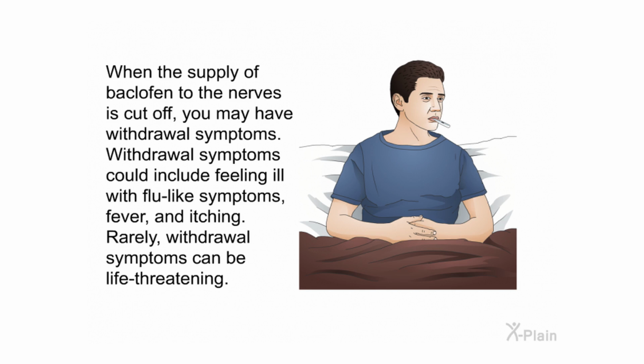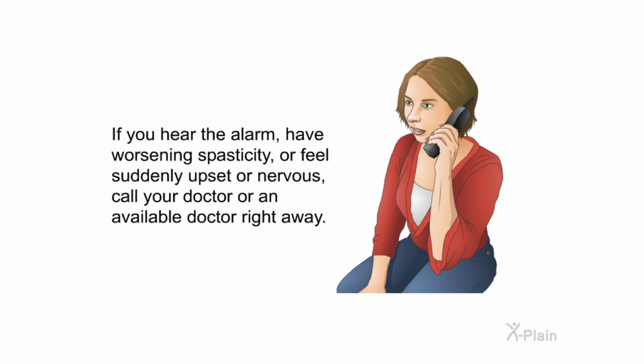When the supply of baclofen to the nerves is cut off, you may have withdrawal symptoms. Withdrawal symptoms could include feeling ill with flu-like symptoms, fever, and itching. Rarely, withdrawal symptoms can be life-threatening. If you hear the alarm, have worsening spasticity, or feel suddenly upset or nervous, call your doctor or an available doctor right away.